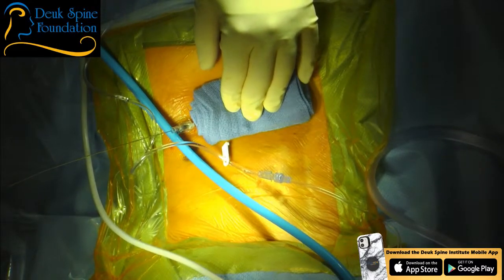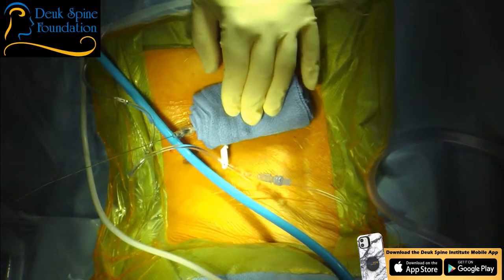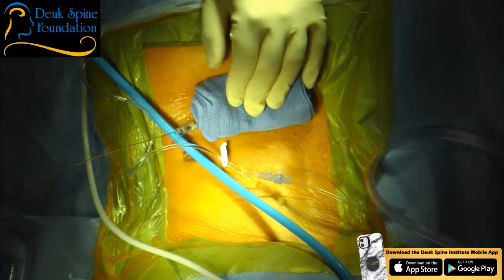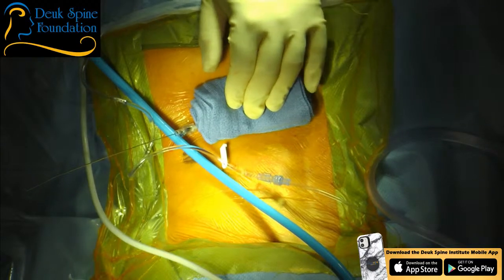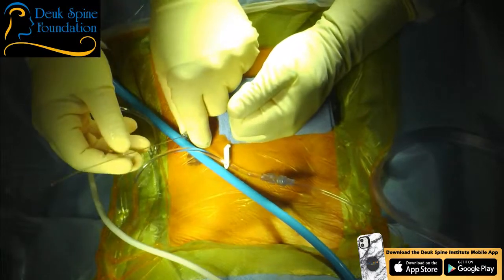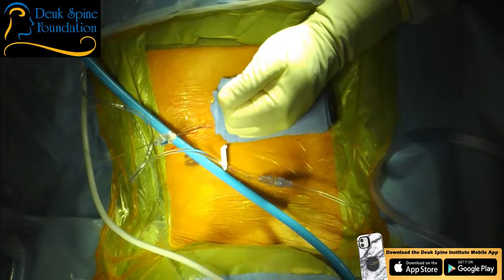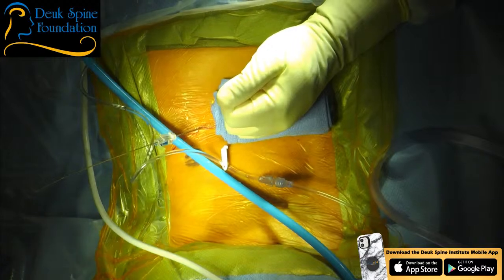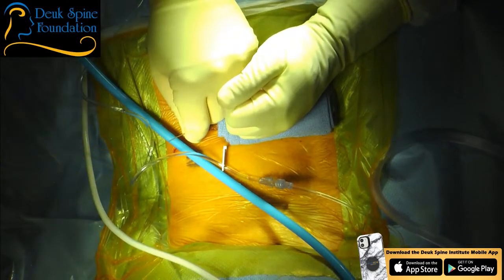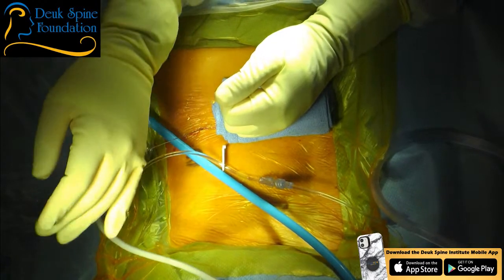Is that your shot? It's too far south, right? So let's get north. Shot. All right. Put pressure here, Sam. Right there. Not too much, just a little bit. No, too much. Shot. Perfect. Okay. We're ready to go and do L5-S1. Make sure you don't pull your guide wire out while you're taking your needle out.